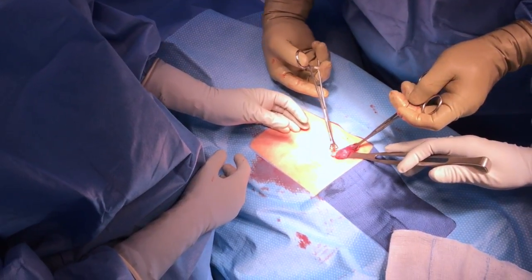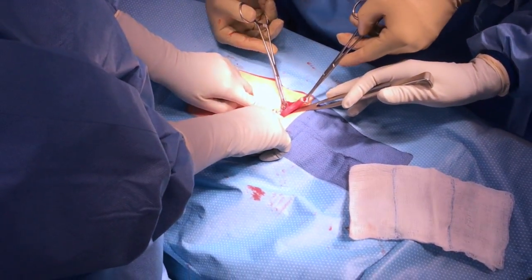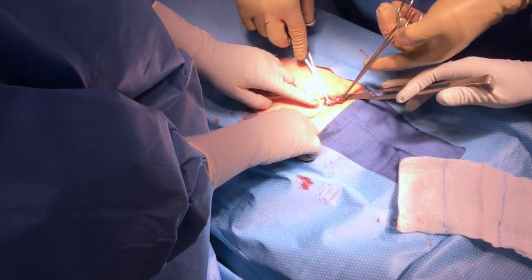This incision is only big enough to stick a finger in. An assistant can hold the retractor now, and it's usually useful to hold it down with some pressure so that the tube isn't under much tension.